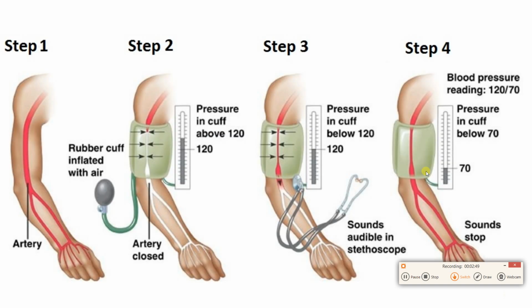All right. Another measurement we can take, besides measuring somebody's heart rate, is their blood pressure. Blood pressure is, of course, the force that is being exerted on the blood vessel wall by the enclosed blood. To do it, first realize we're going to be interested in the blood pressure in this brachial artery here. So we are going to put a blood pressure cuff on it.